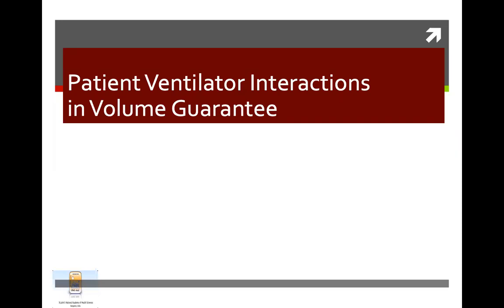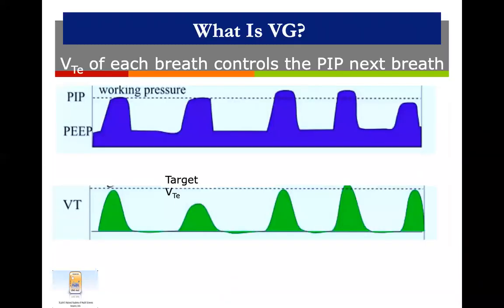I'll give some examples of patient ventilation interaction and volume guarantee, because all of us are using volume guarantee. 2-3 slides on that and then we can end. Is that fine? Yes. So what is volume guarantee?